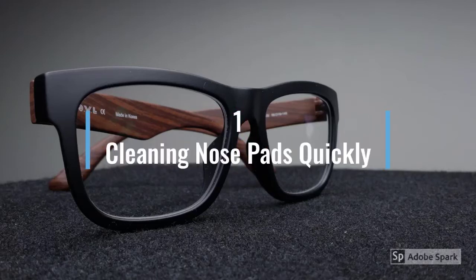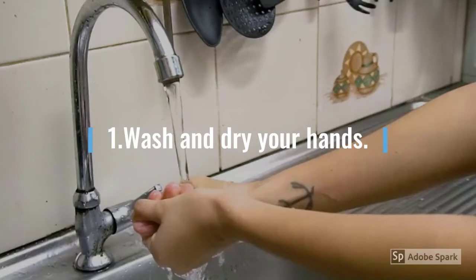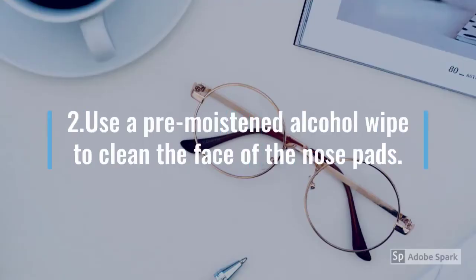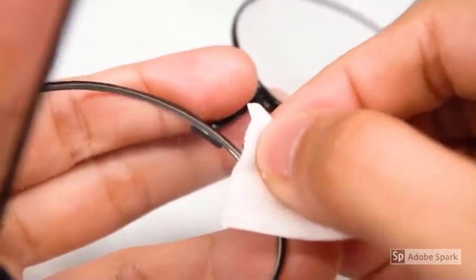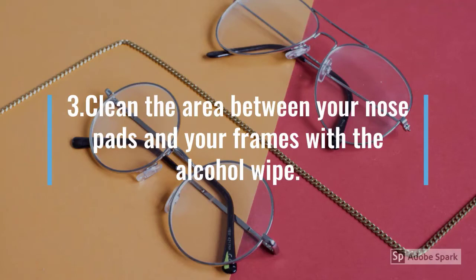How to clean nose pads. Method 1: Cleaning nose pads quickly. Wash and dry your hands. Use a pre-moistened alcohol wipe to clean the face of the nose pad, then clean the area between your nose pad and your frame with the alcohol wipe.